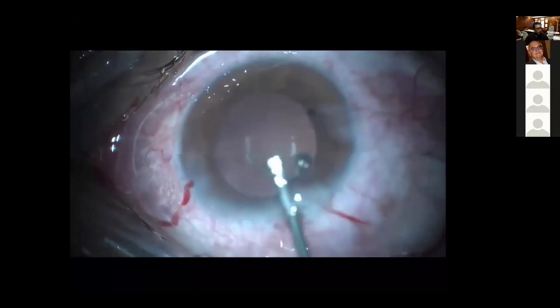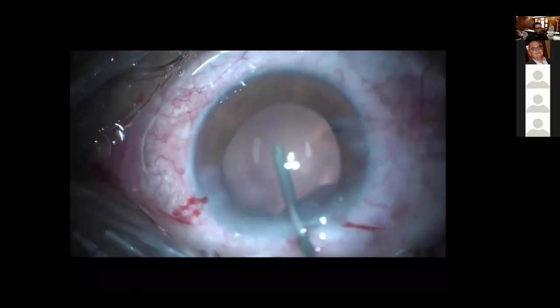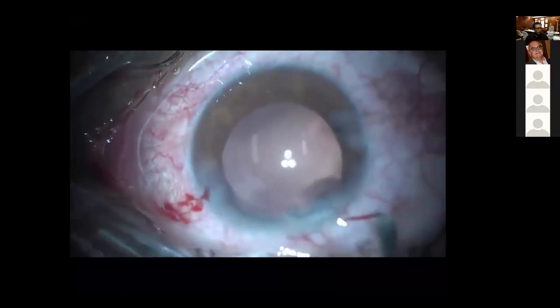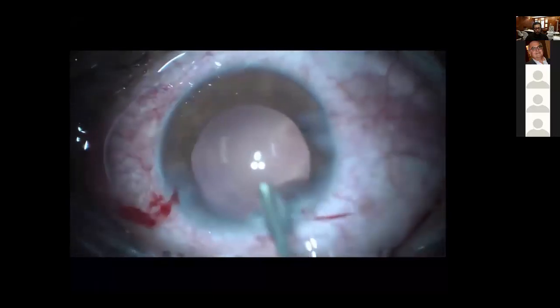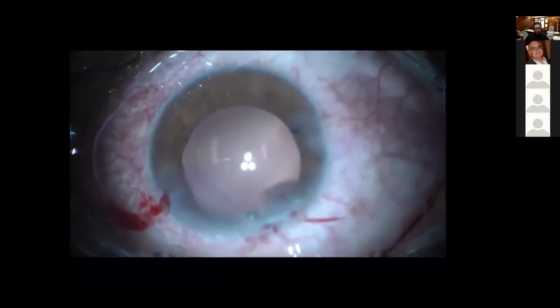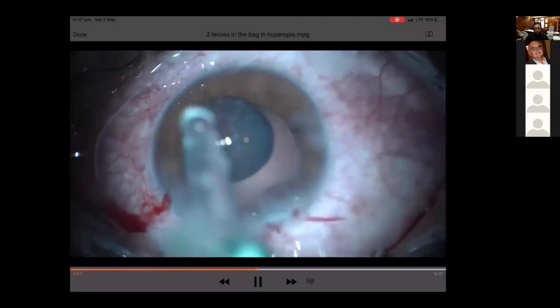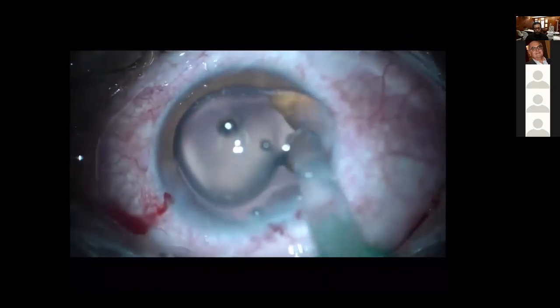You have to inflate the bag as much as possible. It's amazing how the bag can take up two lenses, because usually the amount of lens matter is quite thick, and it allows for easy implantation of both types of intraocular lenses, and it's not difficult at all. But each time you implant an intraocular lens, you have to use an ample amount of viscoelastic. This is the first intraocular lens to be placed inside the eye.